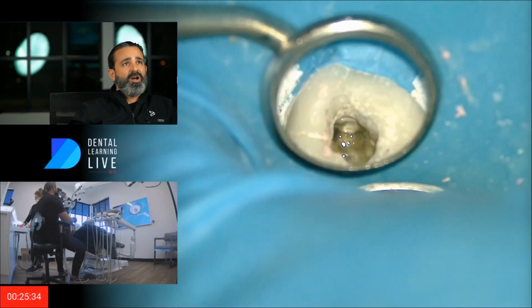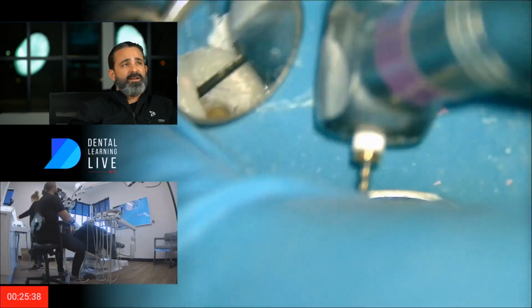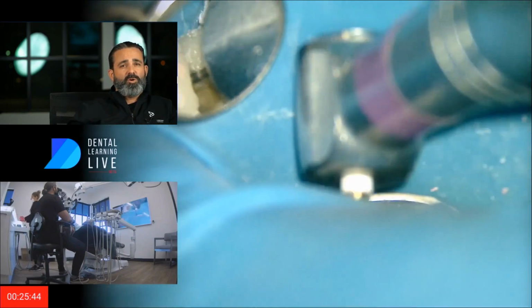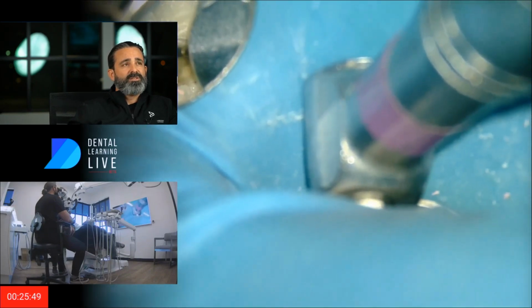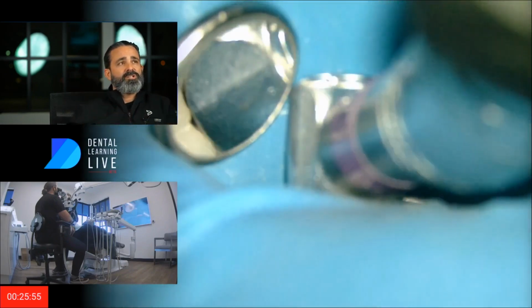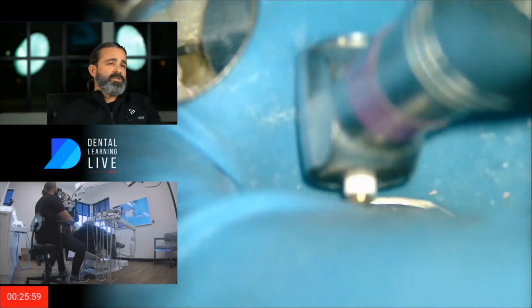I mean, it's trial and error, and it's a lot of trust but verify, and passing files again. And it's certainly down at this level when I'm down to the terminus. I don't want to go long on this. I just want to go to where the gutta percha was to the best of my ability. Tactilely, you can feel it. When you've got the bulk gutta percha out, you can actually feel it bite at the end of those files.